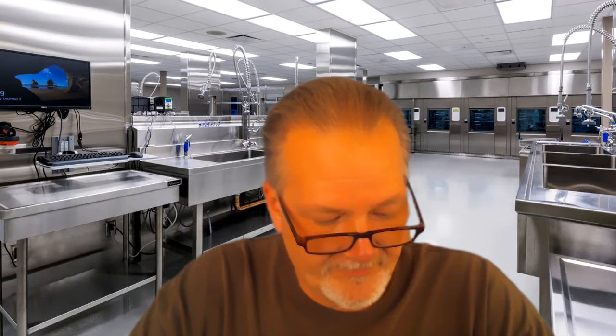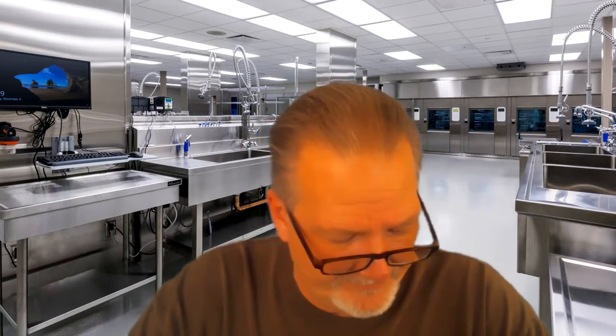So the vast majority, almost everything, I've been in this field for many years, and I never saw a case come down that had prions, which cause CJD, actually on the instruments. But there should be a policy in your hospital for how to dispose of these. It is such a rare occurrence that you are going to need to get the infection prevention department involved. It could end up with these instruments just being completely destroyed and thrown in a burn box.